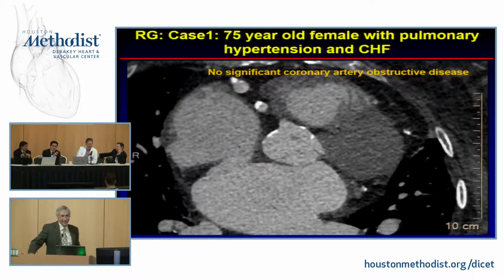Before, after. So actually, it prompts an interesting question. I don't really want to occupy too much time, but we had to actually diurese the crap out of this lady because we were concerned she really did have elevated diastolic filling pressures, right?